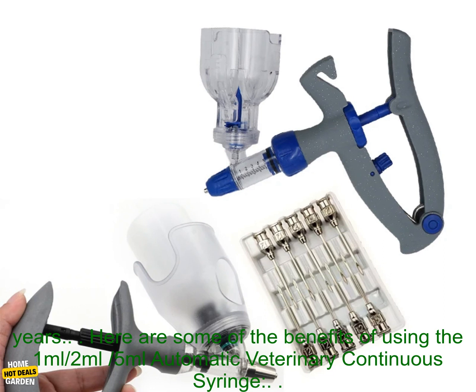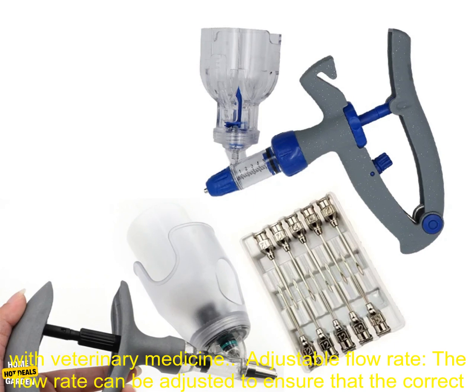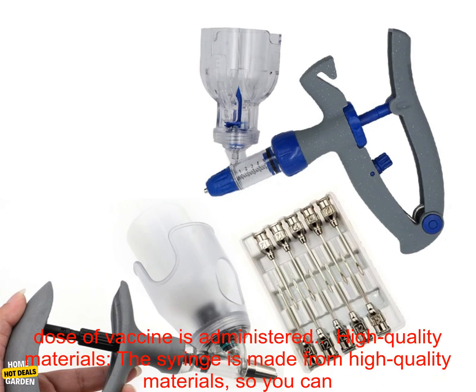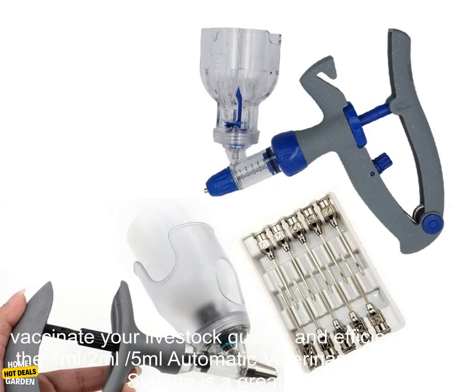Here are some of the benefits of using the 1 milliliter, 2 milliliters, 5 milliliters automatic veterinary continuous syringe. Easy to use: the syringe is very easy to use, even for people who are not familiar with veterinary medicine. Adjustable flow rate: the flow rate can be adjusted to ensure that the correct dose of vaccine is administered. High quality materials: the syringe is made from high quality materials, so you can be sure that it will last for many years.